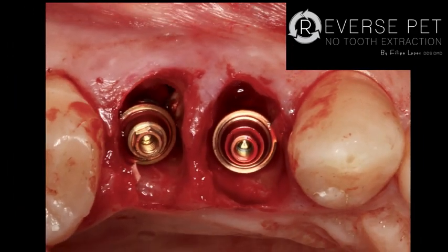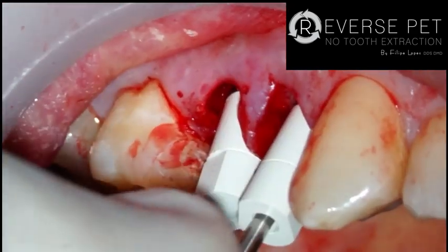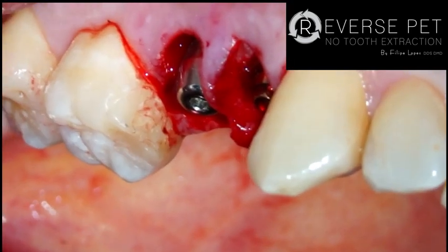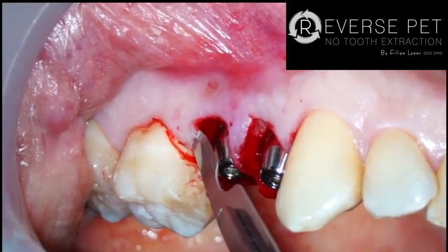As you can see here, you can see the shield, you can see the gap. So this is a beautiful image, because from now on I will work only coronally to these abutments. So my implants are already extended. Okay, so let's see what happens next. Now I am doing the second scan. So I'm scanning the implant position with the Immediat scan. Now I'm putting the healing abutments on top of the multi-unit.